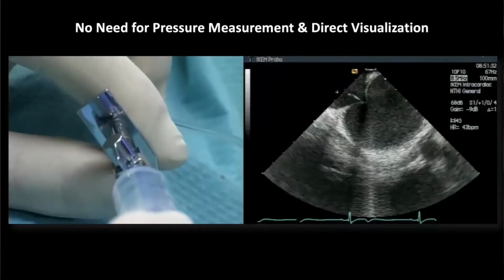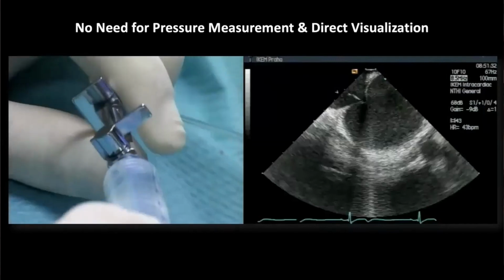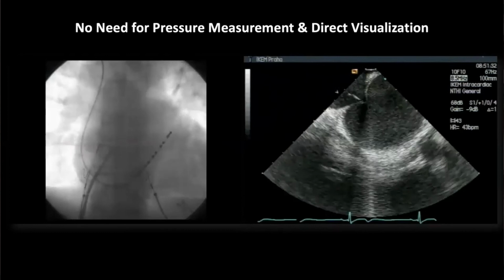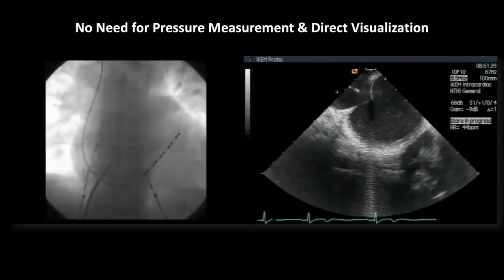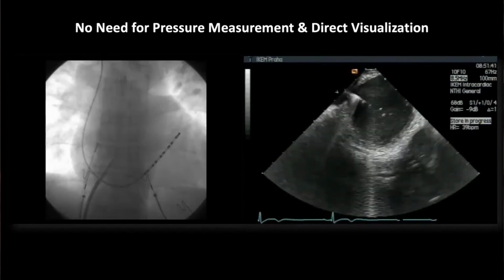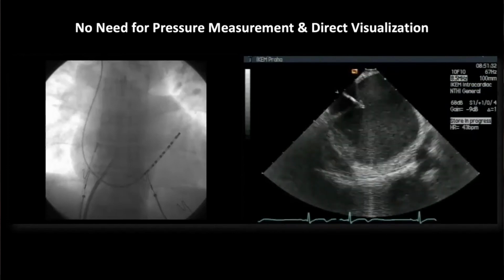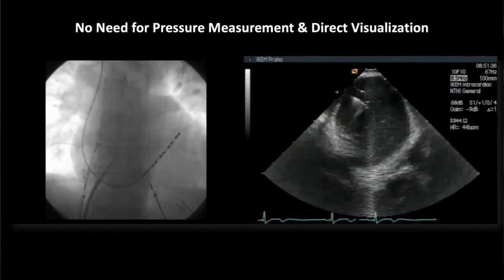Puncture and advancing the needle into the left atrium is the last step of a successful transseptal puncture. Using gentle forward movements with gentle pressure, advance the needle while keeping the transseptal sheath in place. And as gentle forward pressure is applied to the needle, septal tenting is observed on ICE, and then you can see the direct position of the needle in the septum.